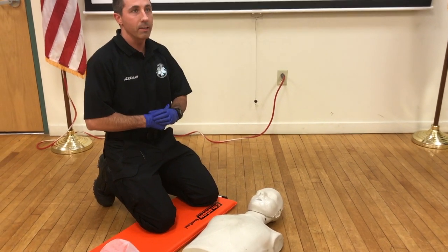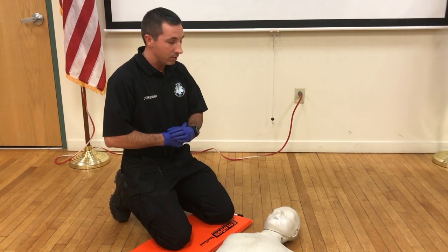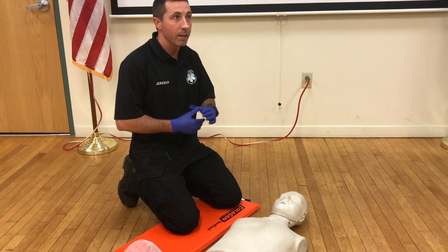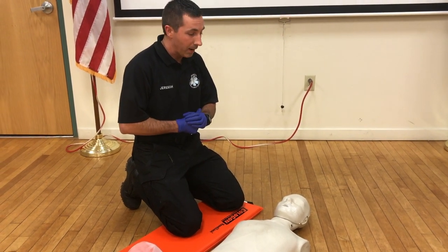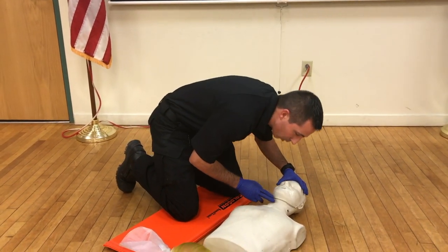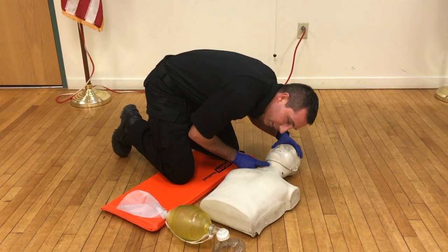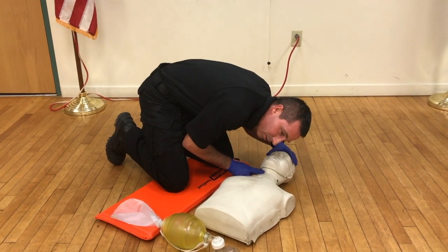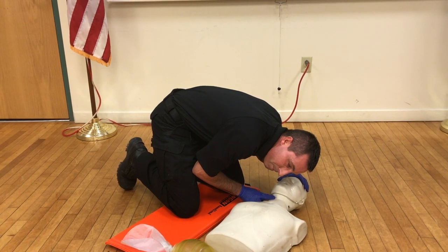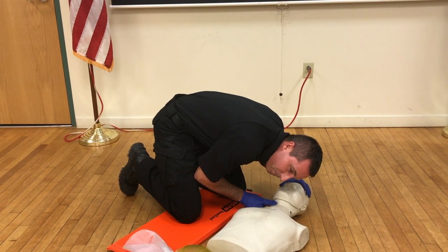I'm now going to activate EMS and call for EMS assistance. I also want someone to grab the AED and make sure they bring it back to me. I'm going to open my airway and assess for a carotid pulse and look for breathing simultaneously for no more than 10 seconds. The patient is unresponsive, apneic, and pulseless.